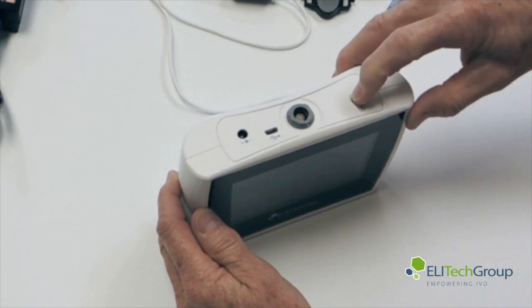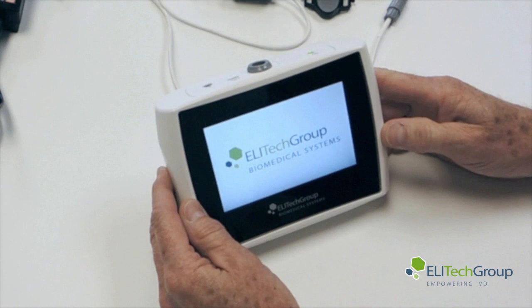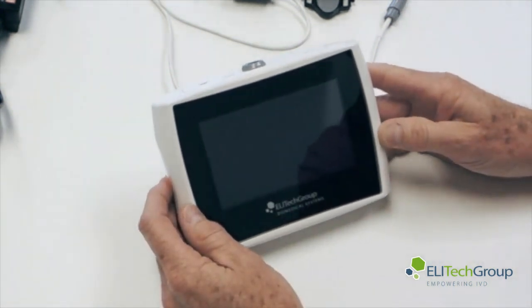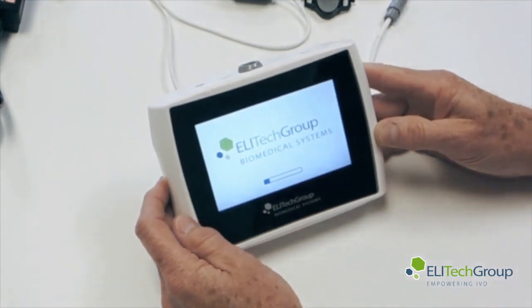If you press and hold the power button, the boot-up screen will come on and it will go through its boot-up sequence. This will take about a minute for it to boot up fully and go to the ready screen.